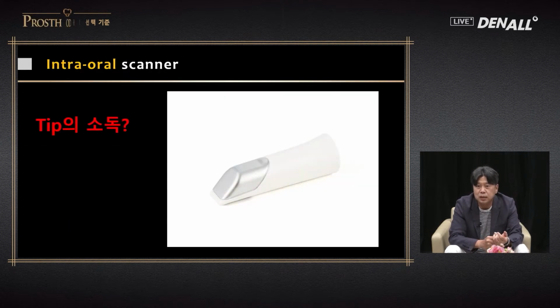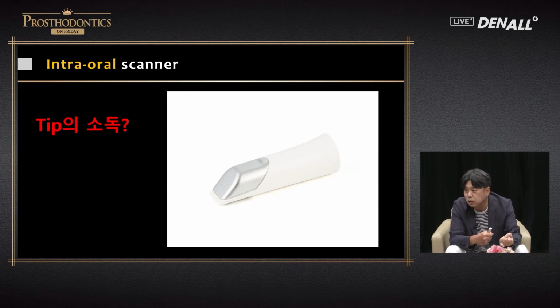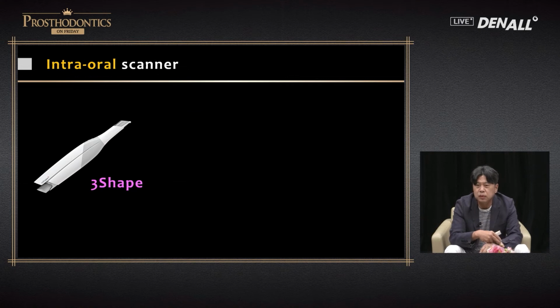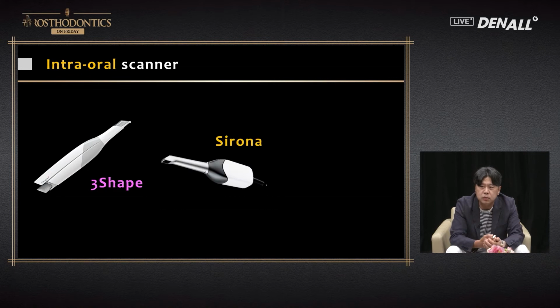Clinically, sterilizing the tip is important. Whether the tip can be sterilized, these days we are sensitive to it. In a dental office, in the past, people did not really pay attention to it. Even the patients, the tip needs to be sterilized. And if it is sterilized, how many times can we use it? Because it costs money. That's why it's important. I don't really want to mention a brand name, but I'm just a clinician. Based on my experience, I can talk about these representative ones.